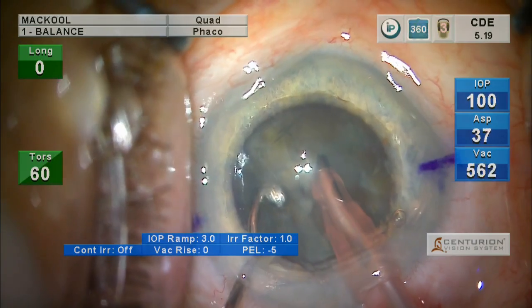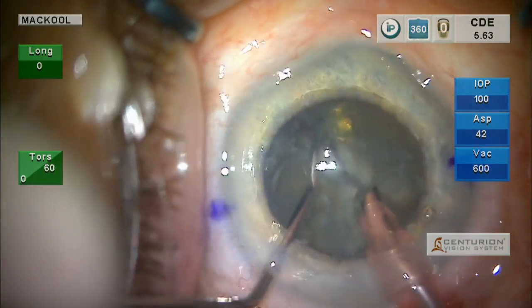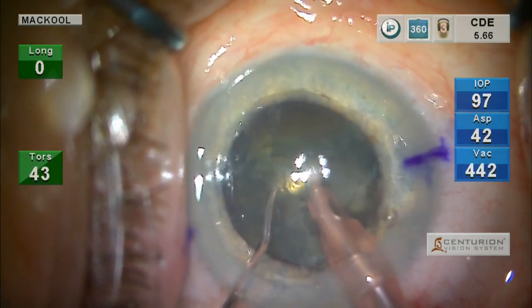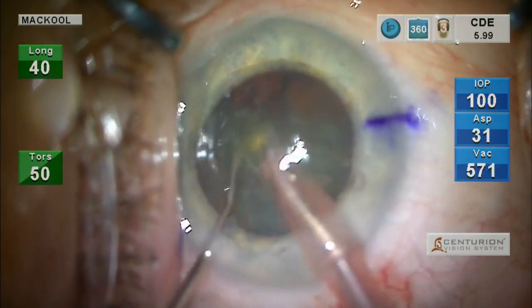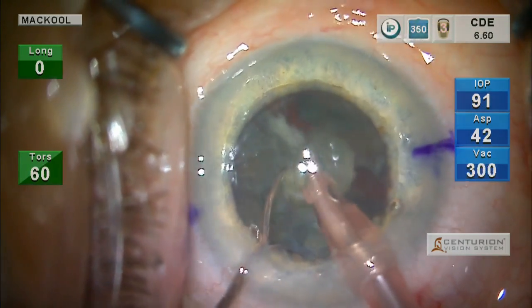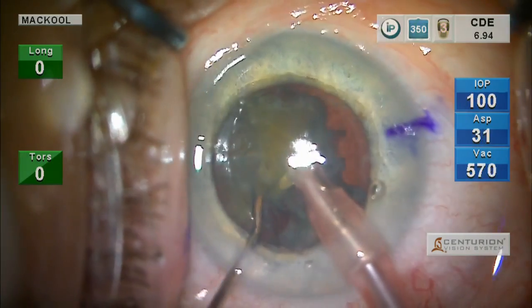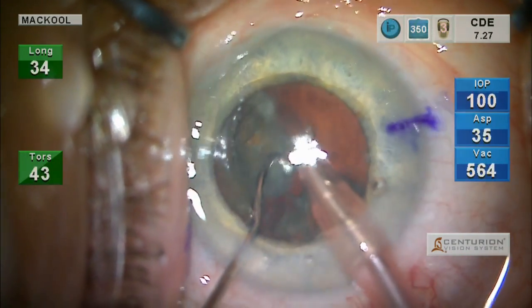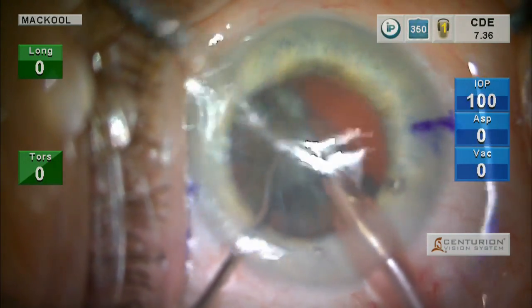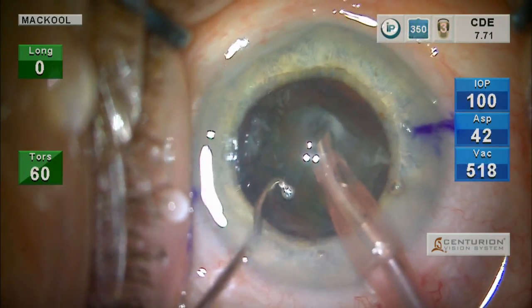Now another thing's coming into play here, and that is epi in the infusion bottle. And that may help to maintain dilation here. Of course, it takes a couple minutes for it to get in there and do its work. Wet the cornea. There's another thing I want to point out to you here, and that is the cornea dries out fairly frequently.